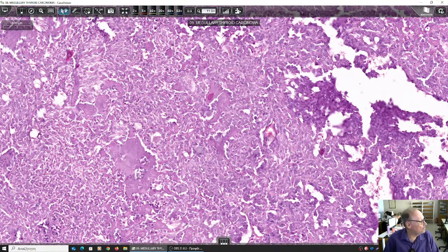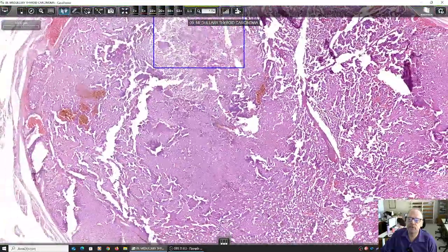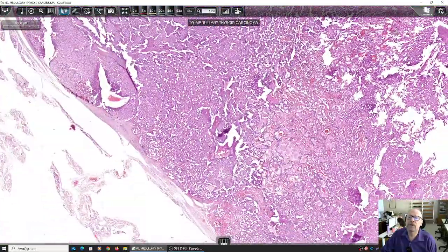These markers are, apart from calcitonin, which in the present case should be positive, which are the markers of neuroendocrine differentiation? Remember? Excellent. Synaptophysin and chromogranin. So this will be positive and will help us define this tumor as a medullary carcinoma.